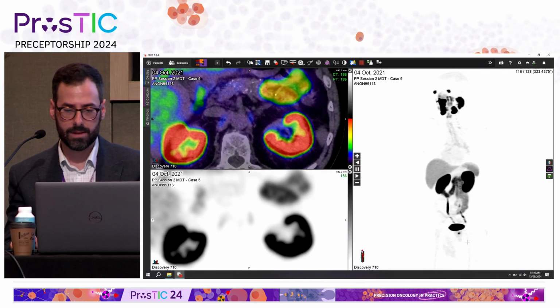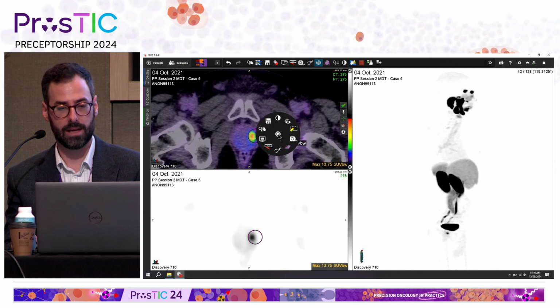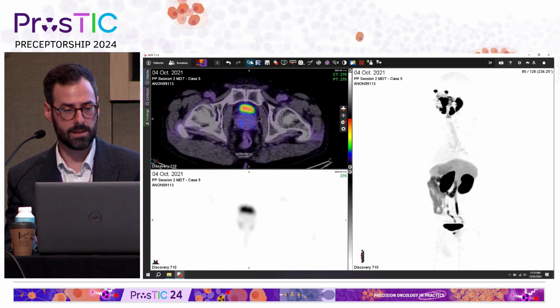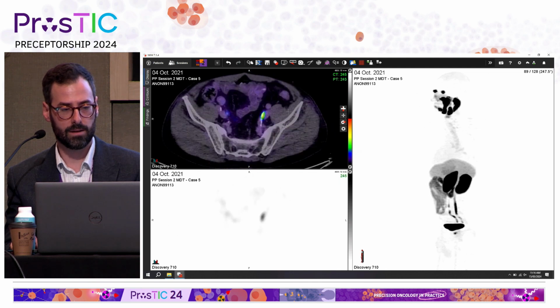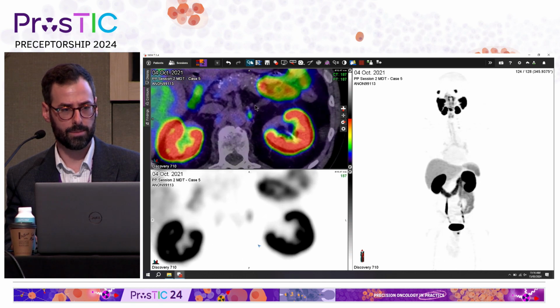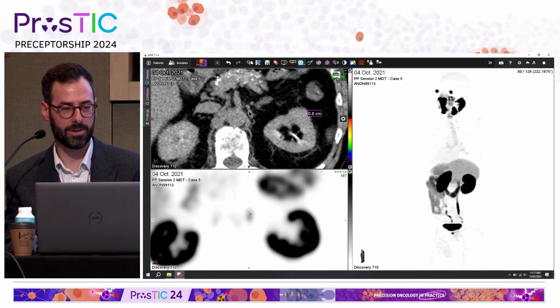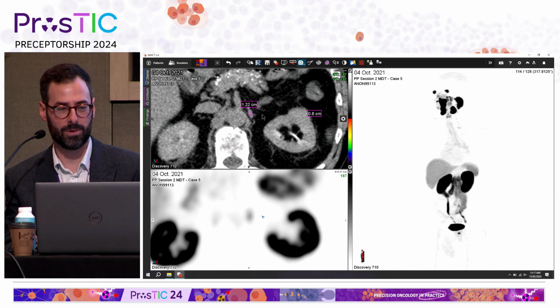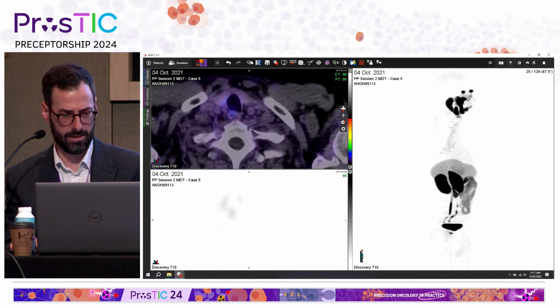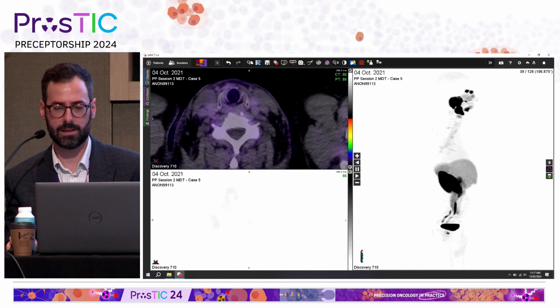All right, so you can see his PET scan. The primary is very avid, so SUVmax of 13.8, so primary score of 5. There aren't any pelvic nodal metastases, so go through quite carefully. Nothing is abnormal. When you come up in the upper abdomen, you do have this little nodular uptake here. I don't know about this. 0.6 by 1.2, a little chunky. Mild uptake, and then you do see some little sites of uptake here. So you don't see any bone lesions, nothing else.